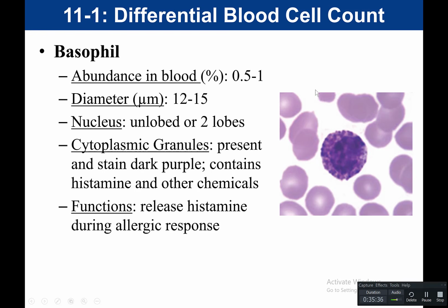Same thing for basophils. Basophils, you're looking for these dark purple granules. That's how you know that it's a basophil. You want to know the function.